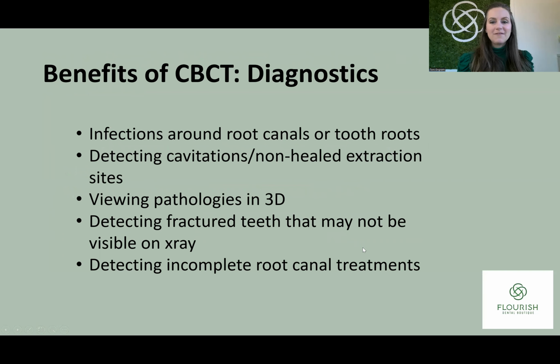Another huge benefit is not just screening, but actual diagnostics. A cone beam CT is just far superior at seeing infections around root canals or the roots of teeth. A lot of times we'll back up what we're seeing on a 2D X-ray and can see it much more clearly on a CBCT, and sometimes they don't show up on the 2D X-rays at all, where they do show up on a 3D.